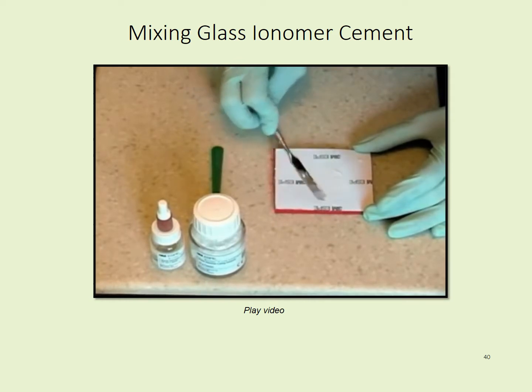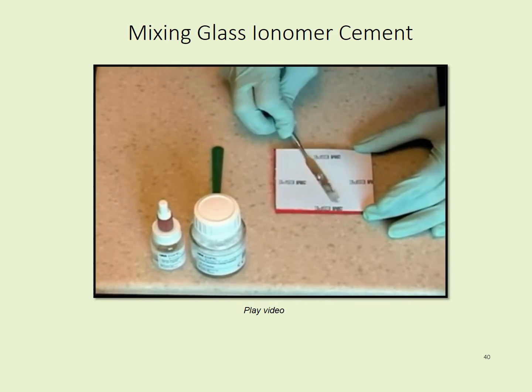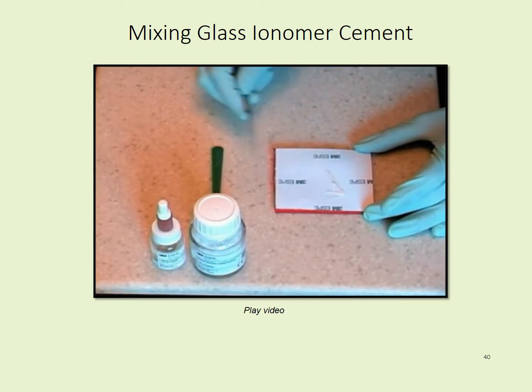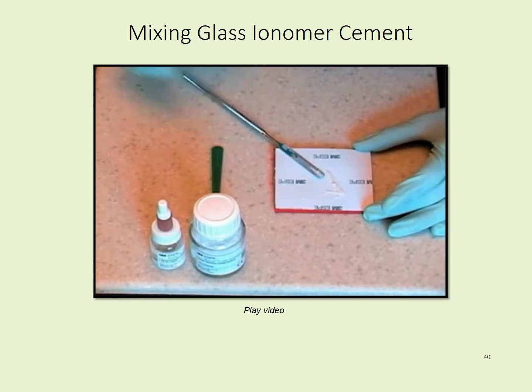Once the mixing is complete, gather all the material into one area. For luting, the mix should be creamy, and as the spatula is lifted off the pad, the cement should follow the spatula for about 1/2 inch before breaking into a thin thread.